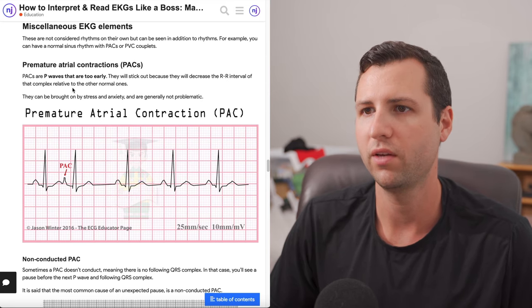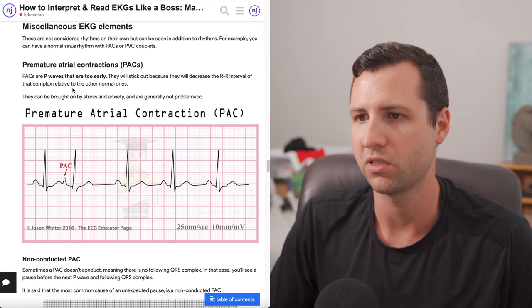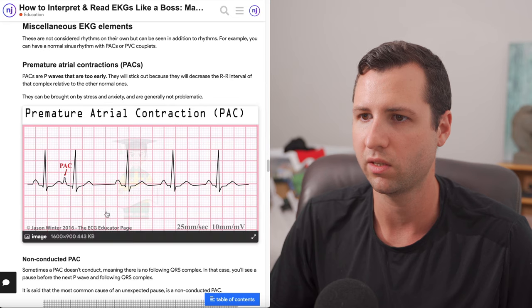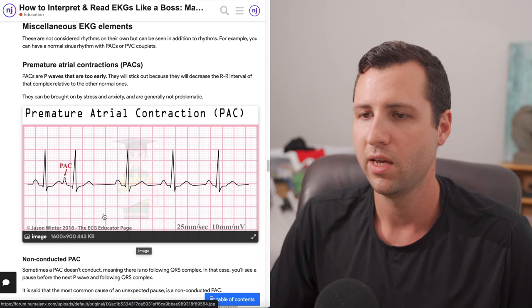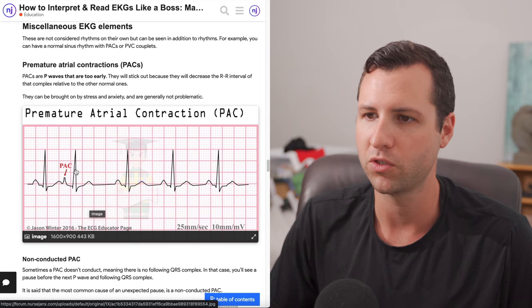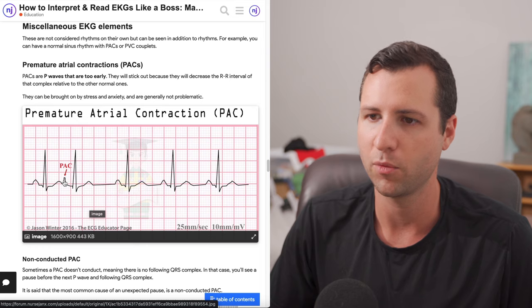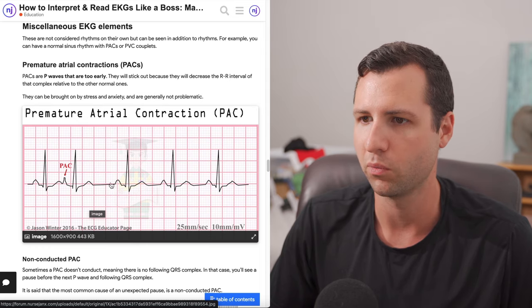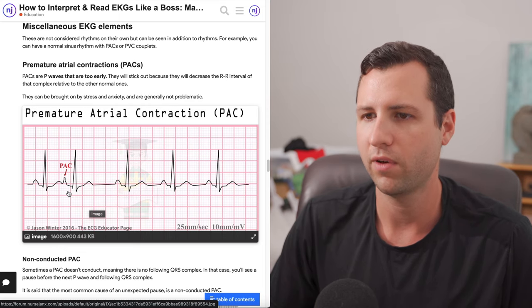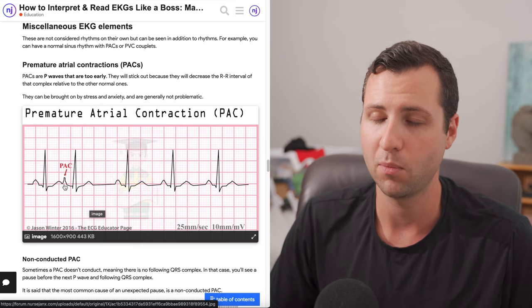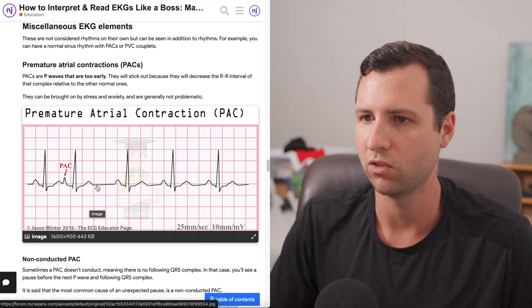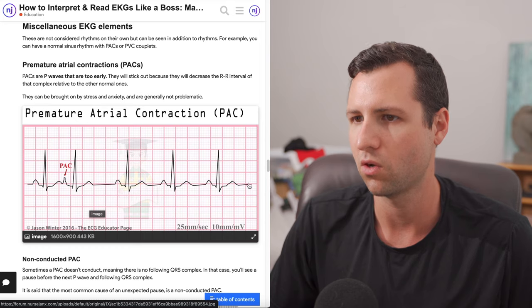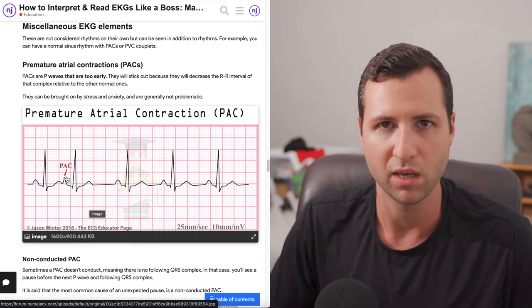PACs are P waves that are essentially occurring too early. They're going to stick out because they're going to decrease your R to R interval substantially. So in this example down here, we see these R to Rs are roughly the same. All of a sudden, we have this complex which is pretty much back to the other one. The PAC is right here, this little guy right here. The P wave does not have to look different like this one does in this example here. The fact that makes it a PAC is because it's occurring really close to your T wave, abnormally close relative to your other waves.